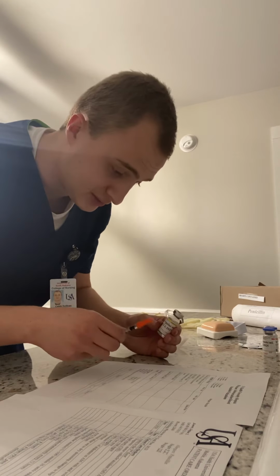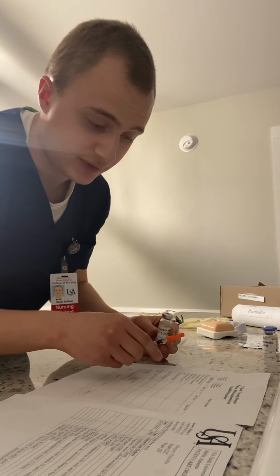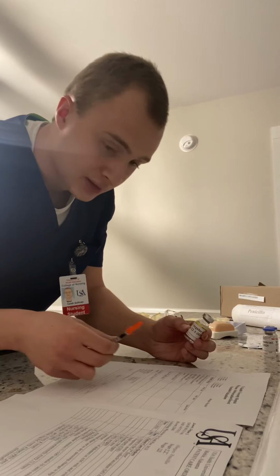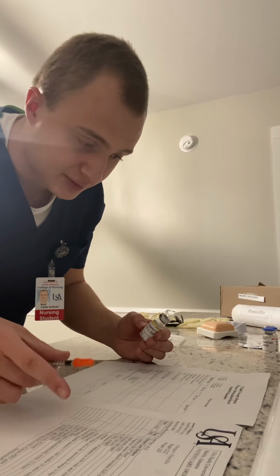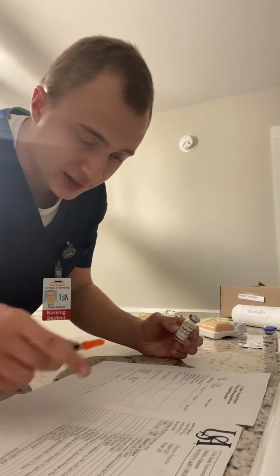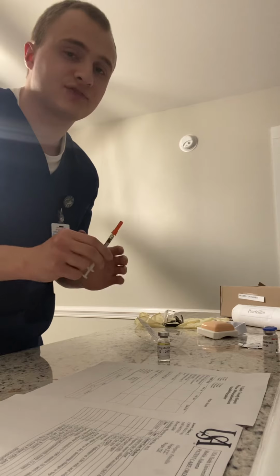Once again, checking my patient, Jaguar J. Jones, medical record number 4176352, making sure I have the right medication, Novolin R, 100 unit per milliliter insulin, or regular insulin, the right dose, 10 units, right route, subcutaneous, and right time, 30 minutes before meals, and I can see it's 30 minutes before, and he has not had the medication in the last few hours.